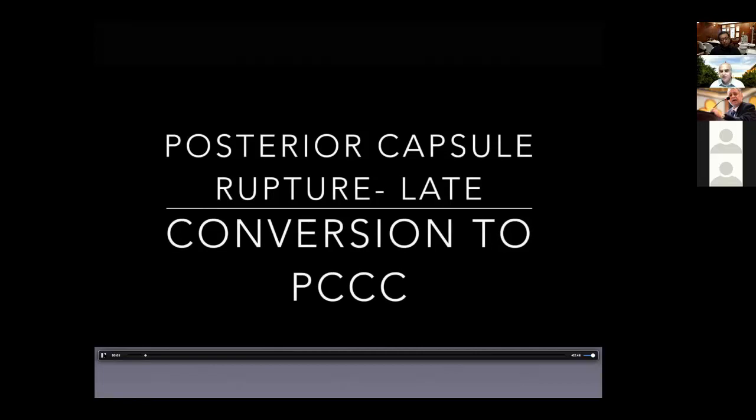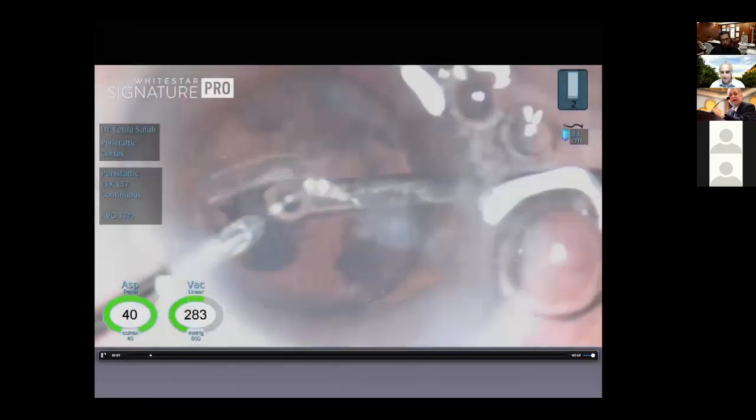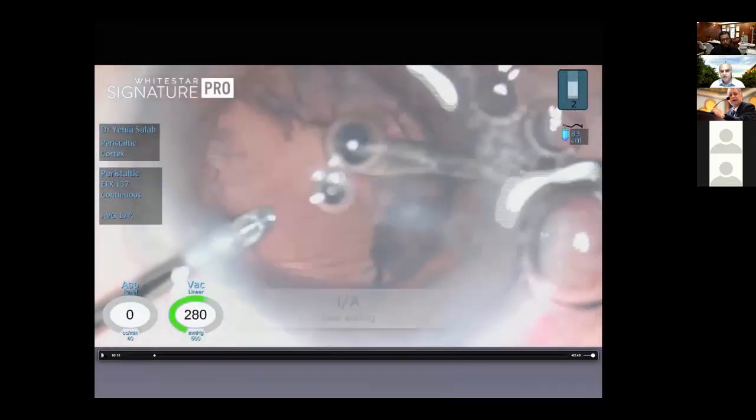So the idea is that the complication can happen at any moment, and one of the disappointments is when it happens during irrigation aspiration. And remember, it is not uncommon. Statistically, 20% or more of posterior capsule ruptures occur during irrigation aspiration, once you start to be more relaxed.